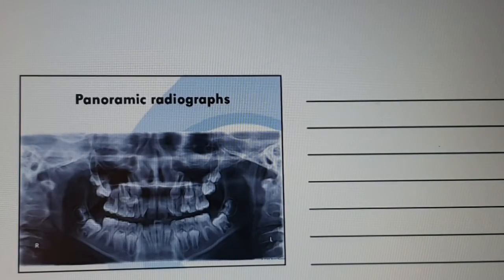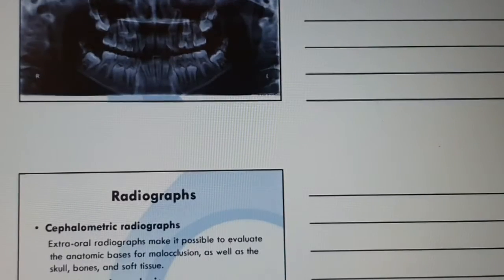So from there, we will be taking panoramic radiographs. As you can see, the teeth are not too narrow, they're not too blurred, nothing's distorted, there aren't any objects that are causing ghost images, there aren't any lead aprons that are causing artifacts. So this is an example of a very beautiful resultant radiograph if the patient is cooperative and no errors are made.